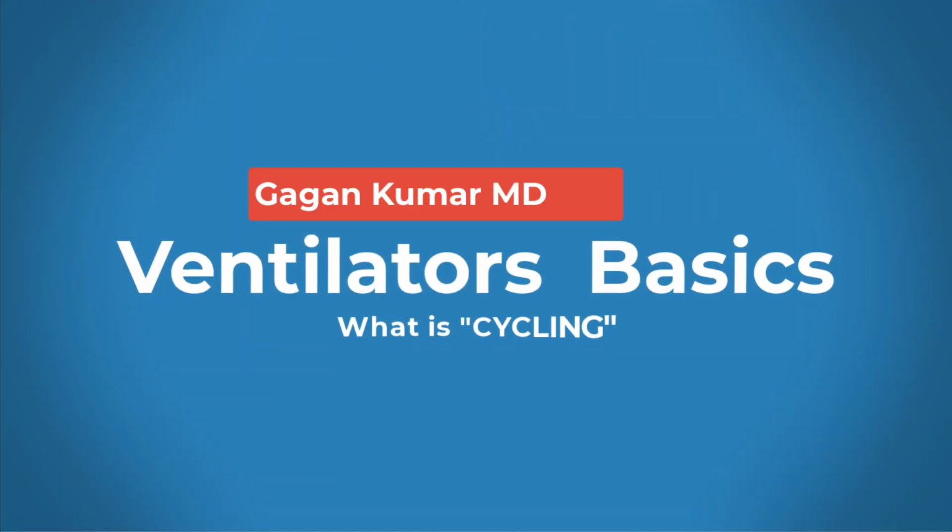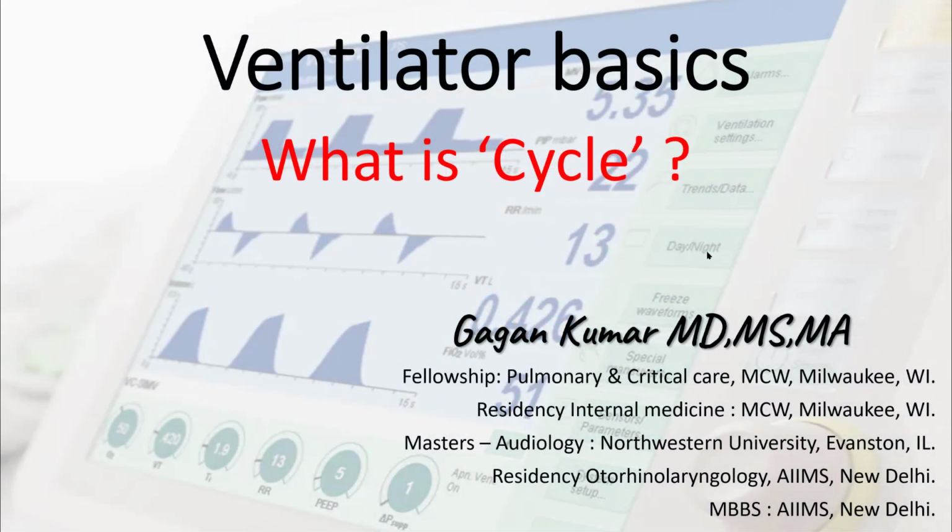Hello everyone. In the previous lectures, we understood that the different ventilation modes differ because they have different trigger parameters, target parameters, and cycle parameters. In this lecture, we'll understand what cycle means.